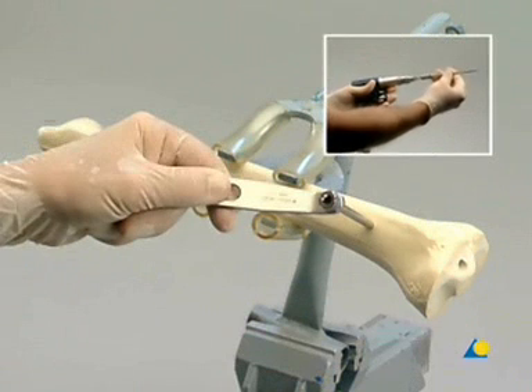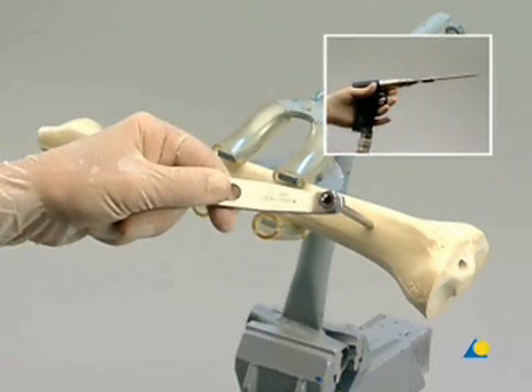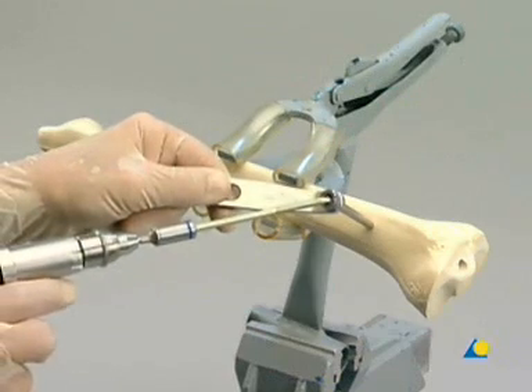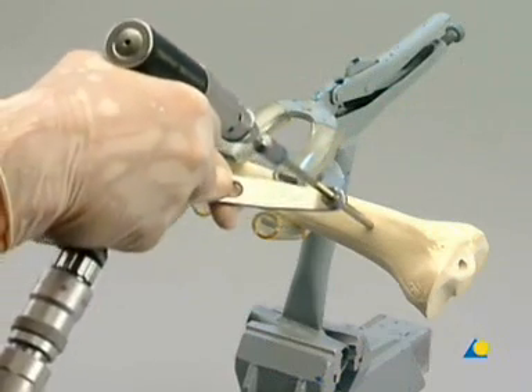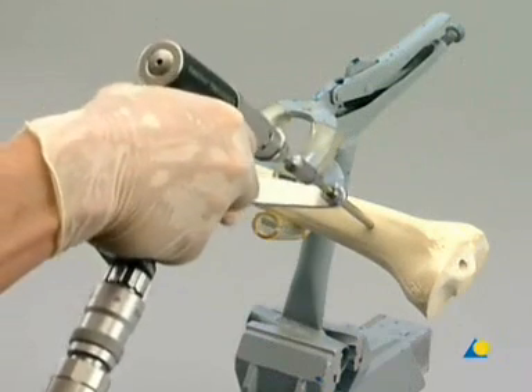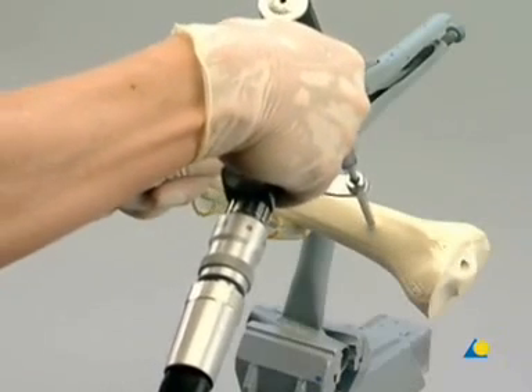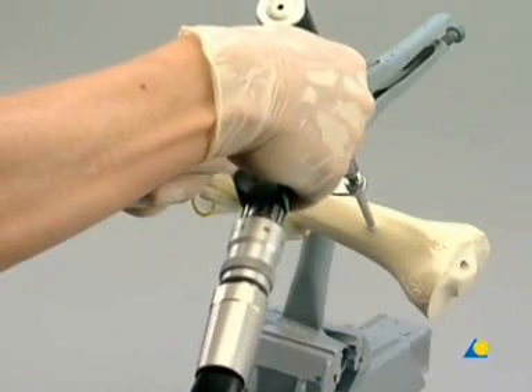A Schanz screw is inserted into the adapter. The power drive is used to advance this first self-drilling Schanz screw through the outer drill sleeve until its tip is anchored in the far cortex. In the clinical situation, irrigation is recommended while inserting the Schanz screws.